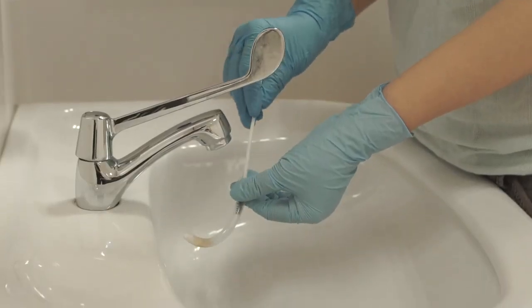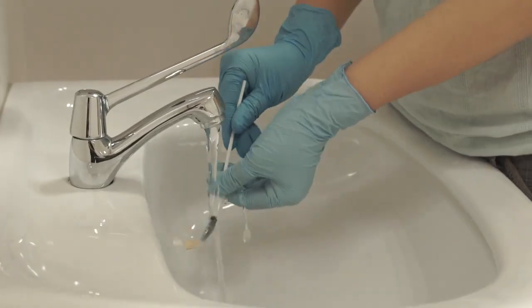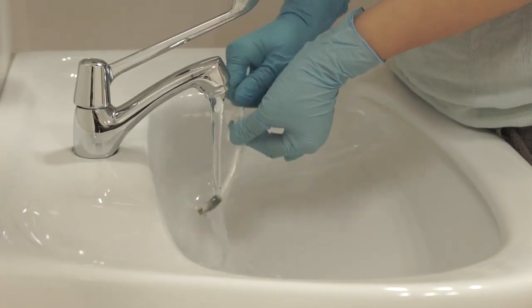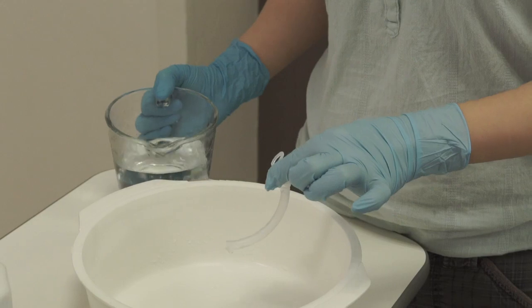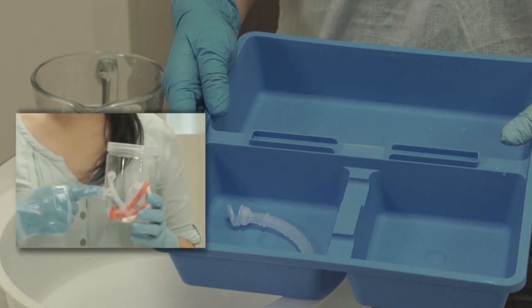Clean the inner cannula with a check brush or soft-tipped straw brush under running water. Ensure complete removal of all crust and secretion stain. Rinse the inner cannula with cool, boiled water. Leave it to air dry thoroughly and keep it in a clean, dry container with a lid.